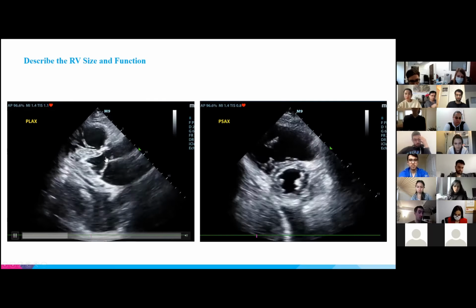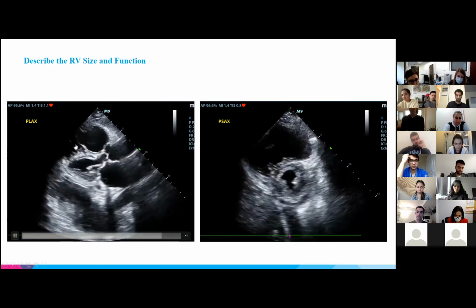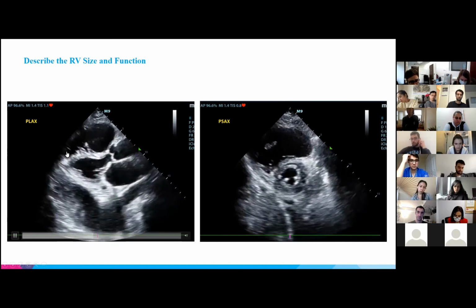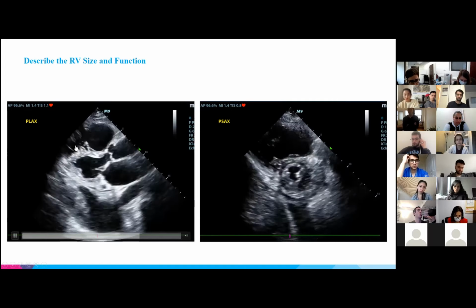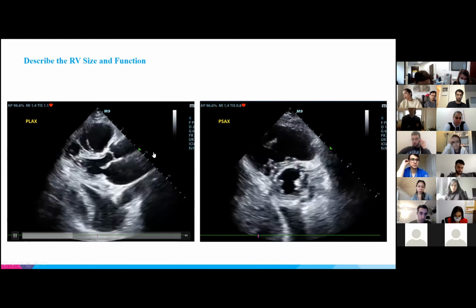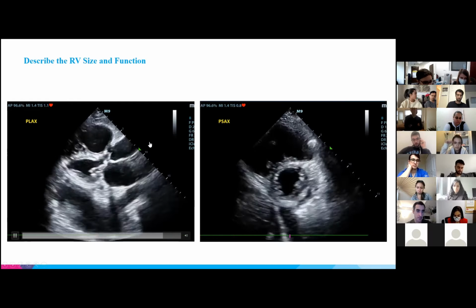You have your left ventricle, aorta, left atrium, RVOT. And again, the RVOT extends all the way down here, which is a very abnormal finding. What else can we appreciate in this view? And is it a pleural or pericardial effusion?